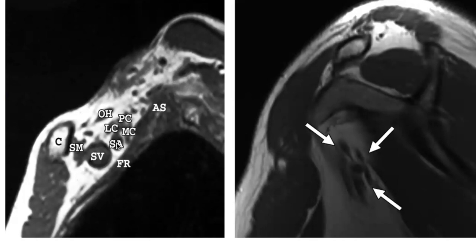This is the oblique axial image here. This is the subclavian artery and the subclavian vein. The cord which is medial to it is the medial cord, the lateral cord is lateral to it, and this is the posterior cord. This is the image obtained somewhat laterally at the level of the axilla. Again, the medial cord, posterior cord, and lateral cord are identified in relation to the subclavian artery.